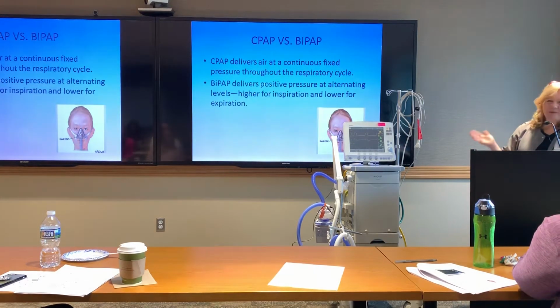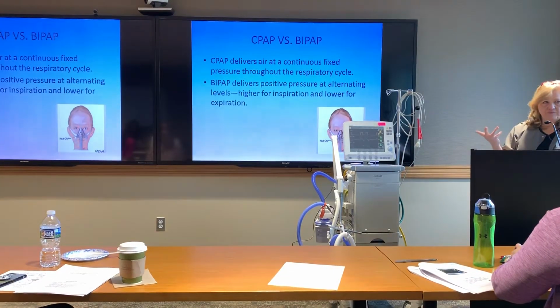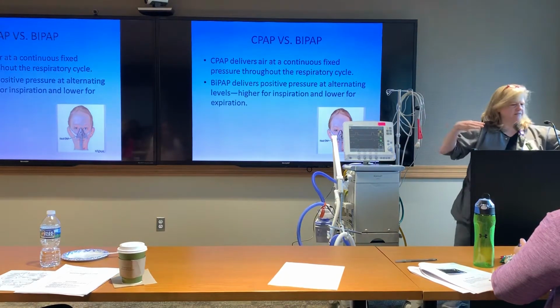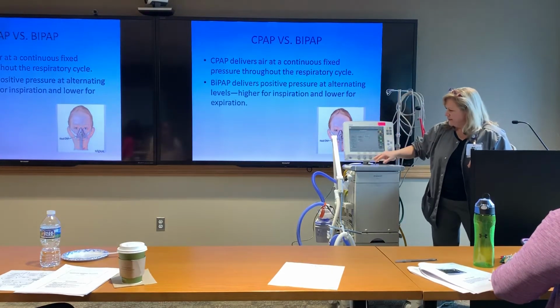All right, CPAP and BiPAP. I'll just talk about BiPAP briefly because you guys do use BiPAP, right? Okay. BiPAP we generally do with the V60, but we can do it through this ventilator as well. Right. If you look at this, it's hard to do. If you look at the screen right now, whoops, not right now. Don't look at it right now. Previous mode.